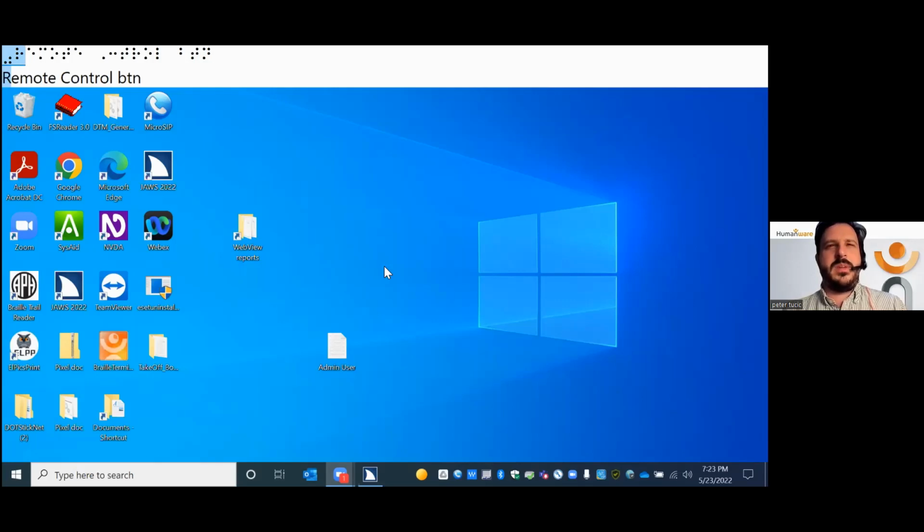It will keep the same name. But if you export, it will ask you for what you want the file name to be. I am going to export this file. And to do that, again, it's a BRF file. I've typed some notes. I want to export for whatever reason and turn it into text.